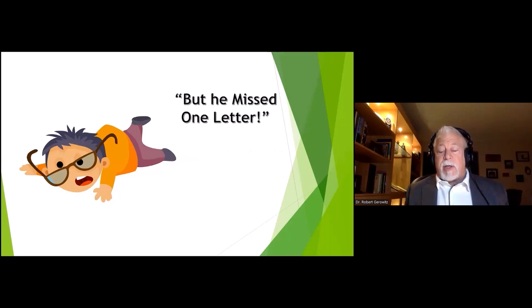When my patients come into the exam room, the first thing I ask them is, how are you doing on your program? And I call this the key question, and I write down exactly what they said. So not only does this give me a record of their perception, but it allows me to counter objections that may be raised.